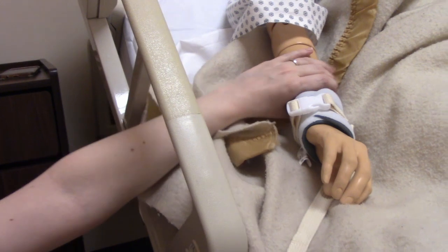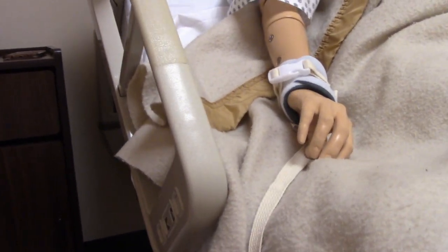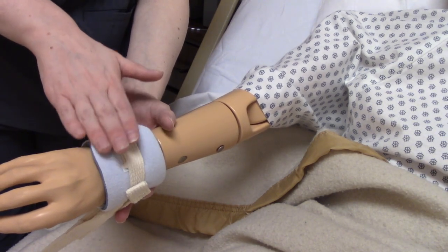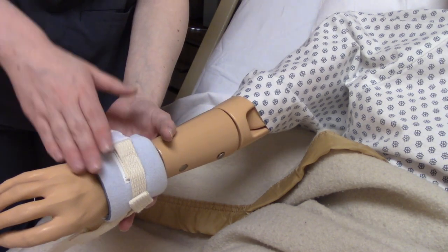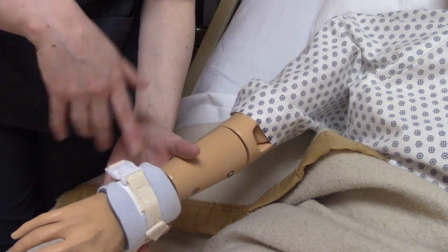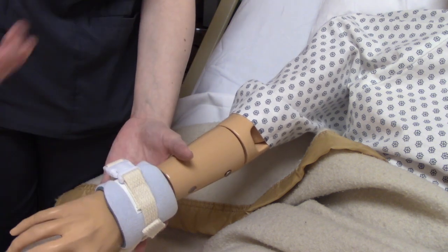So now your patient is nice and secure and they're safe. A patient in restraints needs to be assessed every hour by the nurse. So what are we assessing? We're assessing the restraint itself — making sure it hasn't been damaged, gotten twisted, or is too tight or too loose.